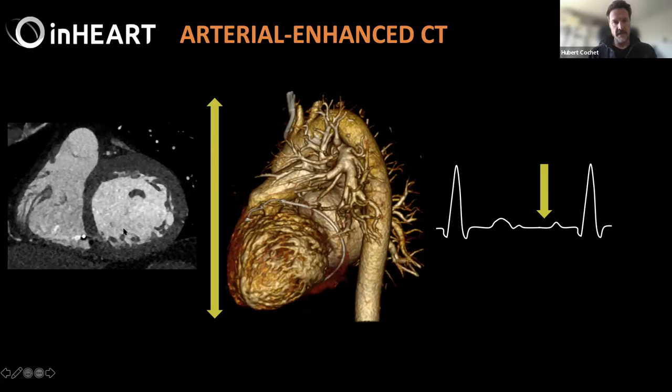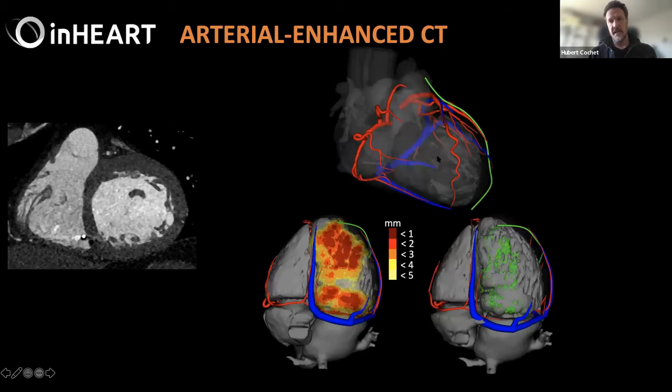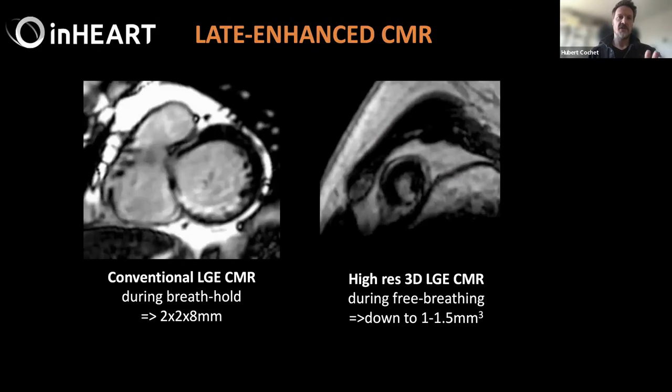And in this very standard acquisition, there's a lot of information. There's a lot of anatomical information, but also substrate information. We can extract from these images maps of wall thickness, maps of intramural fat or calcification, and this helps us guiding catheter ablation in most patients, particularly in post-infarction patients. In some patients, there are intramural scars in areas with preserved thickness, and in these, we need late enhancement imaging. And for that, the best way to go is to use MR.